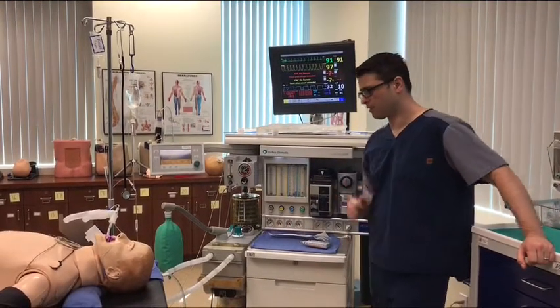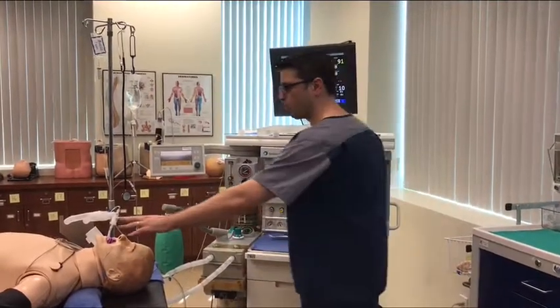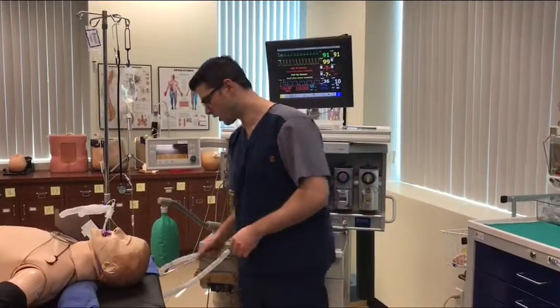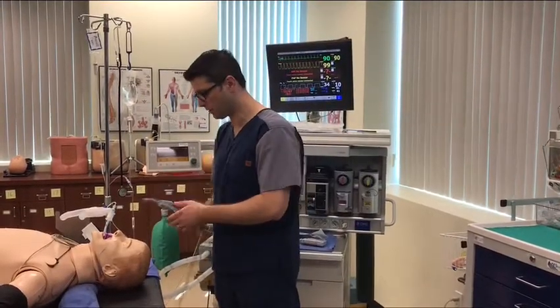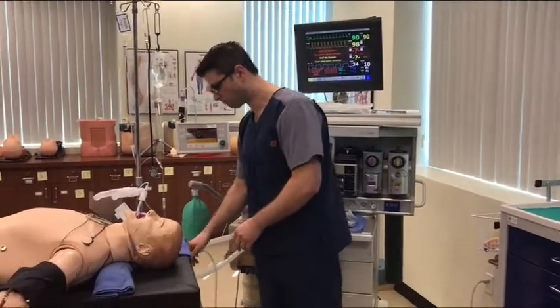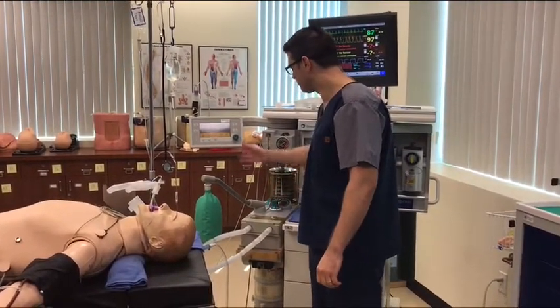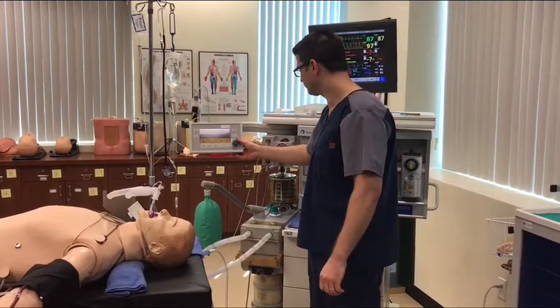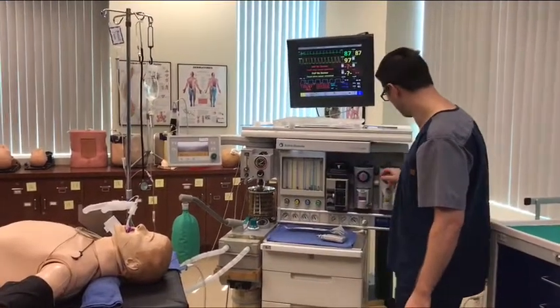I want to get my tools ready. Do you have your tools ready? I have my OPA and I want to have my suction. Make sure it's suctioned and make sure it's working. You're good on that. We already established you're going to let that blow off gas for a while, so we don't need to touch that.